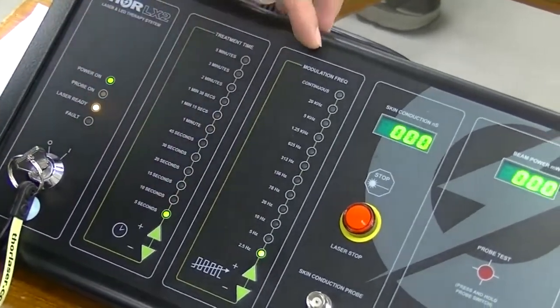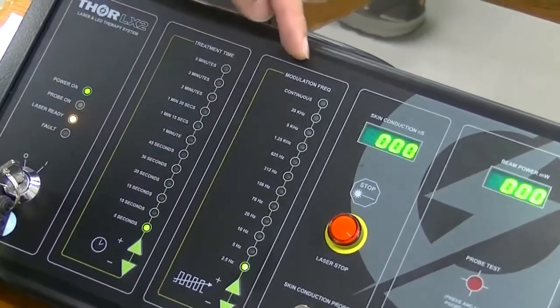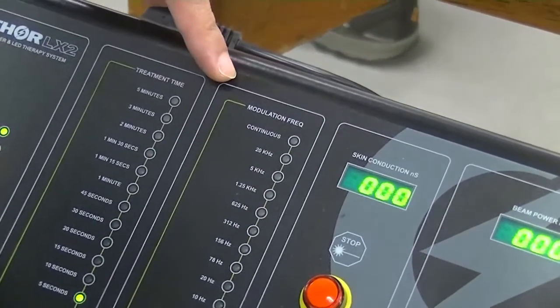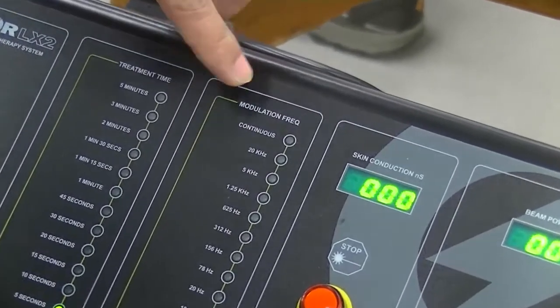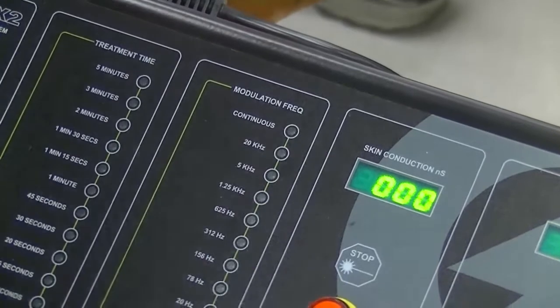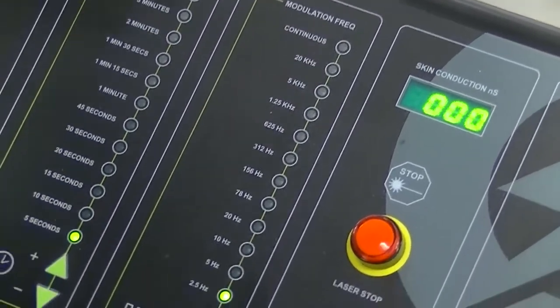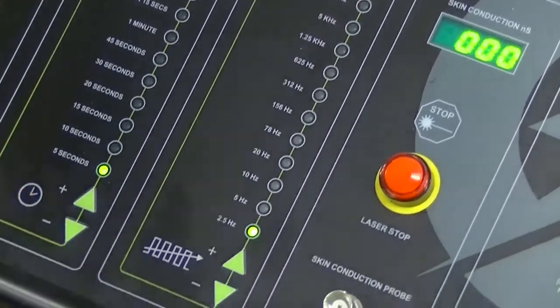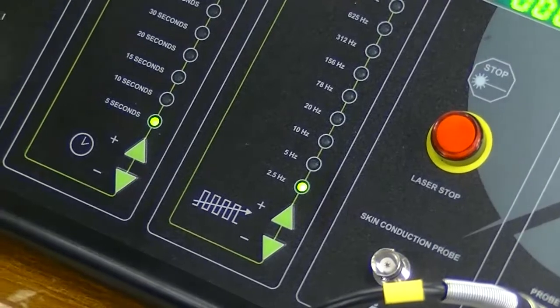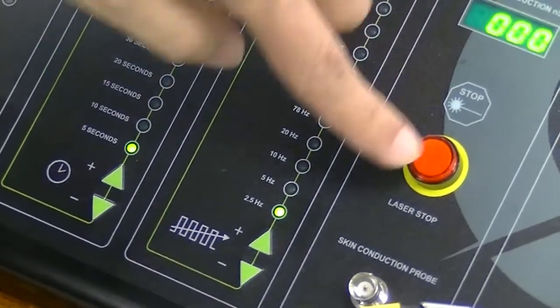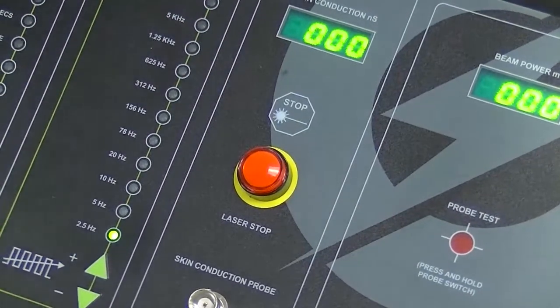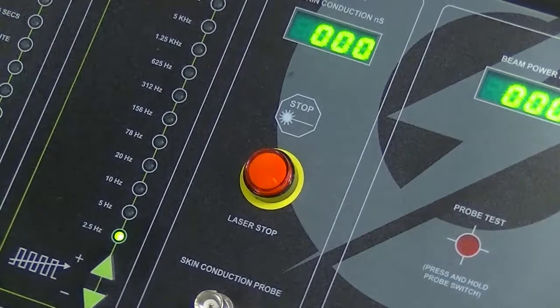There is another panel for treatment frequency. For acute cases we use a lower frequency, and for more chronic cases we go for a higher frequency. There is also a stop button so we can stop at any time in case of emergency.